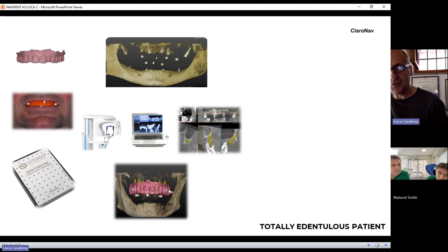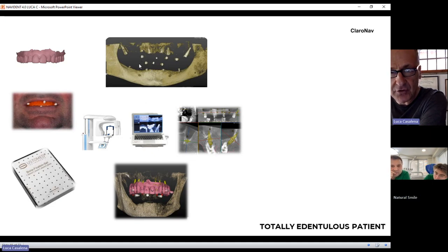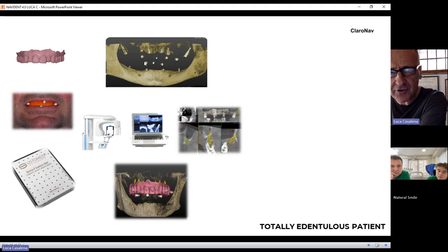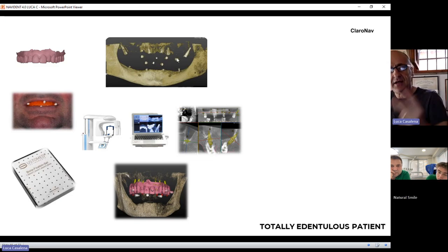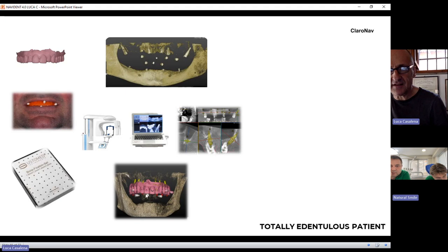You register the STL file by using the dots: pick one dot on the STL, then click the corresponding dot on the DICOM; a second dot on the STL, a second on the DICOM; a third on the STL, a third on the DICOM. Three dots are the minimum, though you can use more. After three dots, you register the STL file onto the DICOM files.